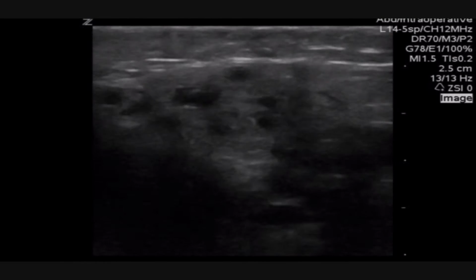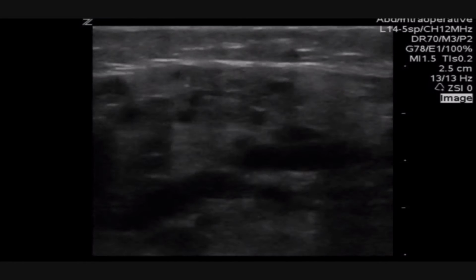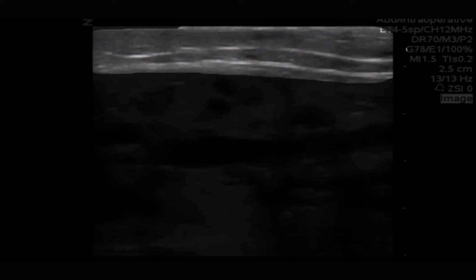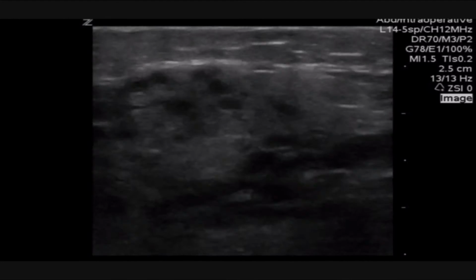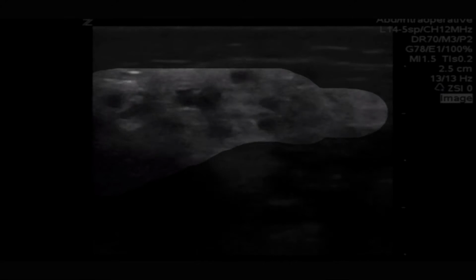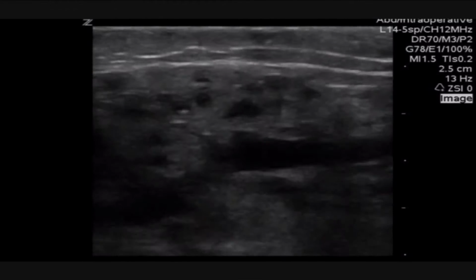Here we are in the soft tissue of the neck. The tissue at the very top of the image, or the most superficial tissue, appears pretty normal. No evidence of cellulitis or cobblestoning. You have sort of fascia, muscle layers. And then you have this sort of expansive tissue underneath that, sitting right on top of a couple blood vessels. That's our thing of interest, the thing that is pathologic. Below that also appears like normal soft tissue.